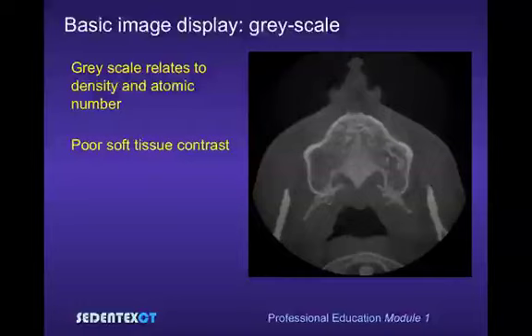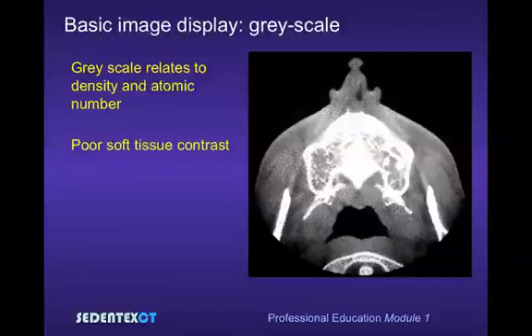One aspect of cone beam CT is that there is relatively poor soft tissue contrast. As you can see on the picture on the right, the images that we get are similar to bone window medical CT scans. If we really turn up the contrast on our controls, we just start to see some differentiation between muscles and fat appearing in the CT scan.